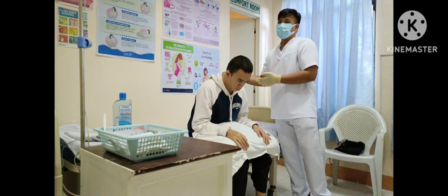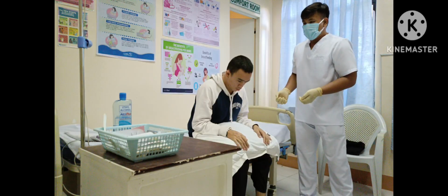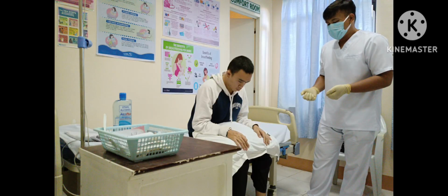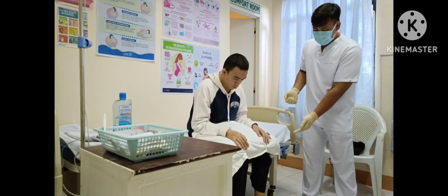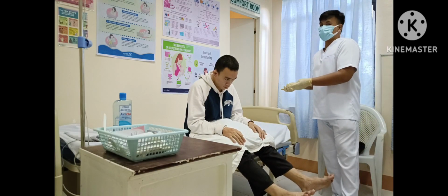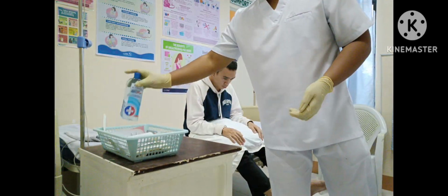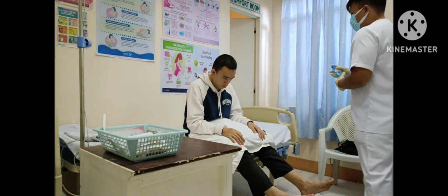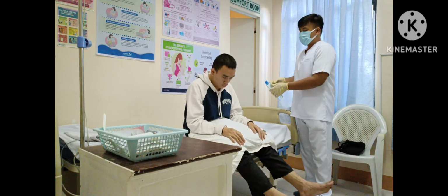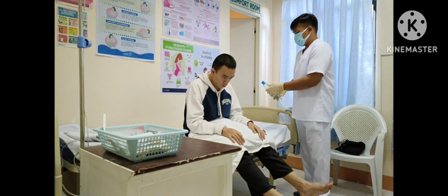Assuming that the doctor is now inserting the needle in the patient's lumbar area, it's important for me to instruct the patient to straighten his legs while the doctor is injecting. So sir, can you please straighten your legs, sir? Okay, so once I've instructed that, assuming the doctor is now aspirating, and this is a sample container, I'm going to put this on the side so the doctor can put the sample that he extracted from the patient's spine here.